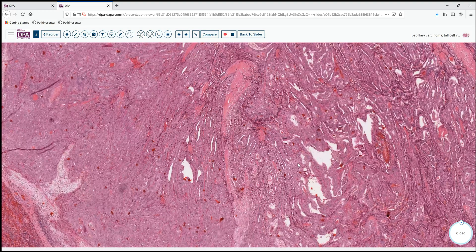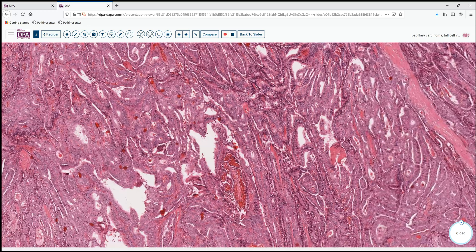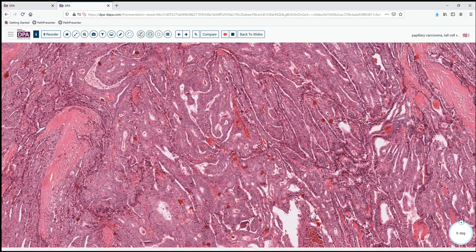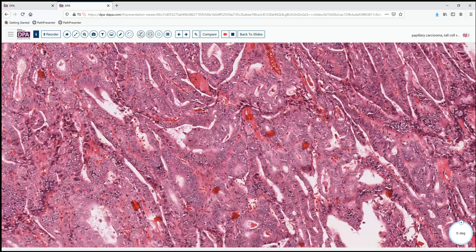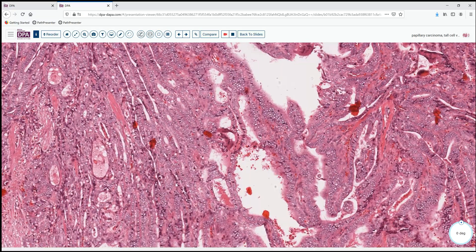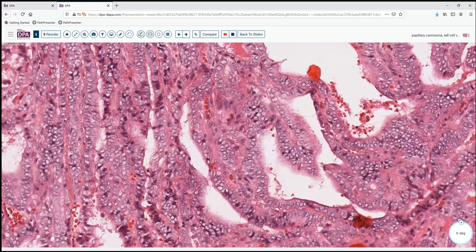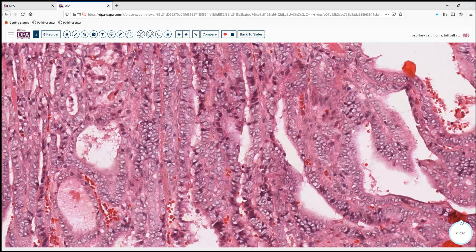We're not seeing a lot of follicular structures, certainly not much in the way of colloid. And as we look at these cells, we see many of them have a fairly columnar type of phenotype in areas. We can look around and we see a lot of clearing of the nuclear spaces. And as we look at the nuclear features, certainly this sort of empty vacuolar or vacuous appearance to the nuclei would be strongly suggestive of thyroid papillary carcinoma. Many of these nuclei are also overlapping.